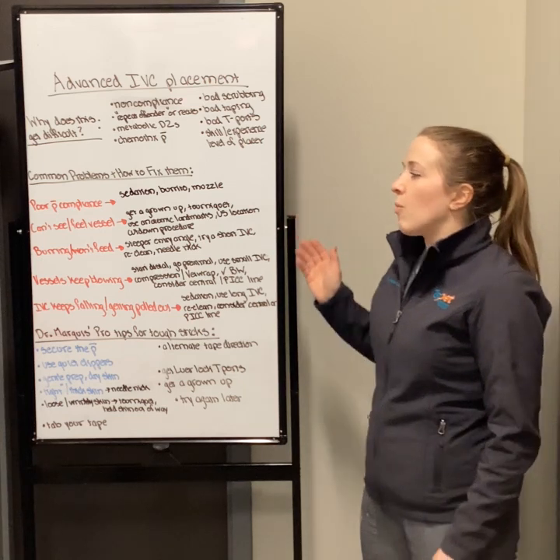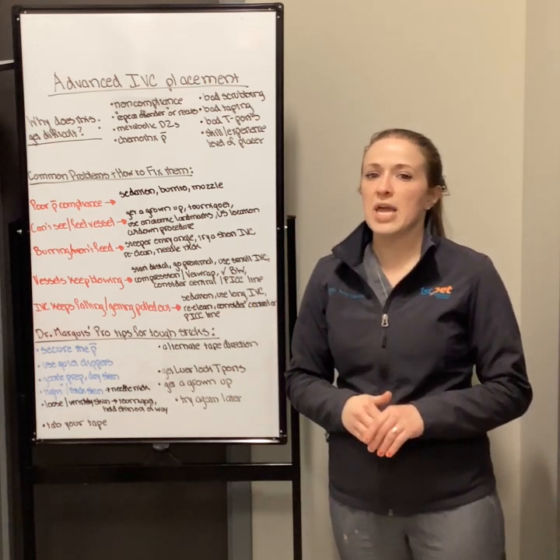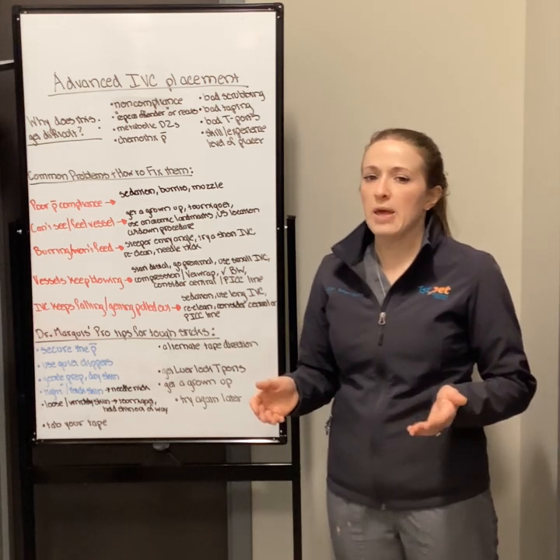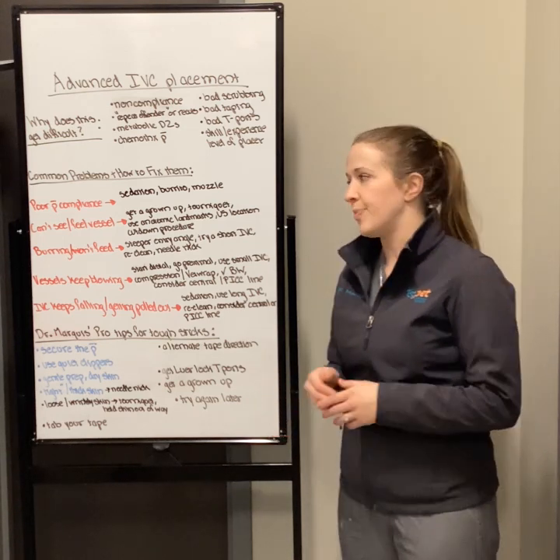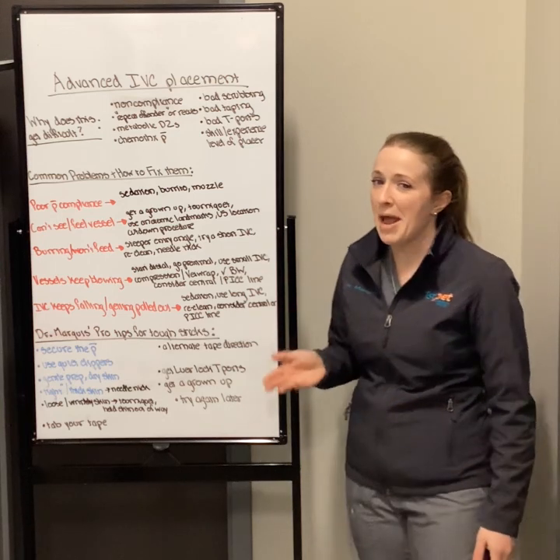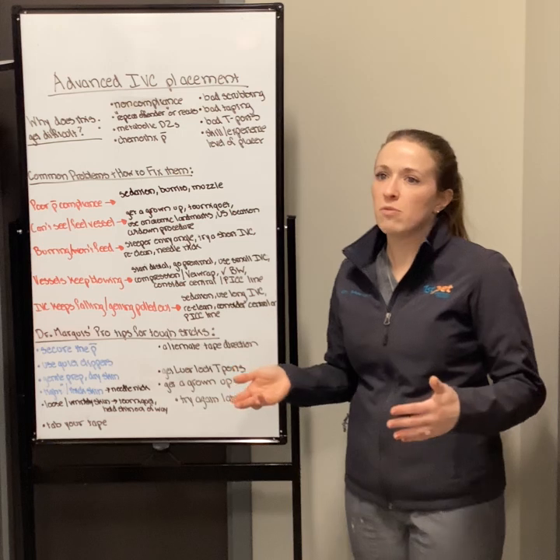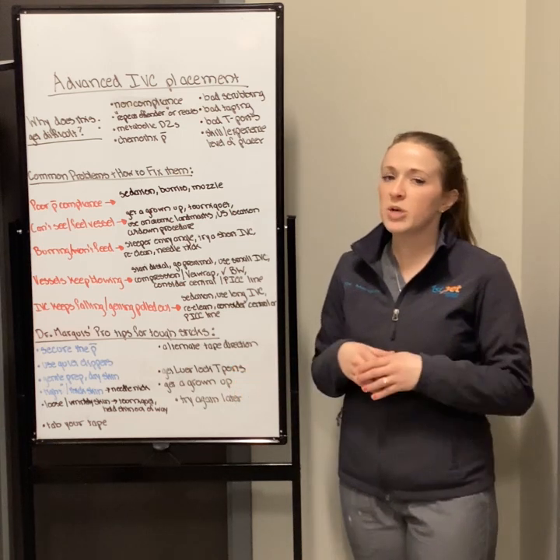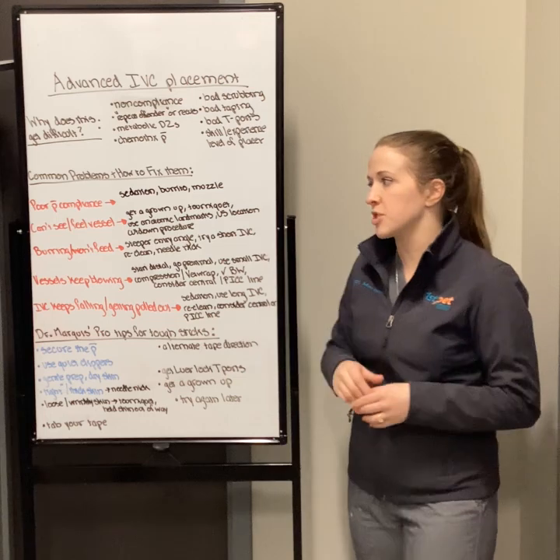So now I want to talk to you about a couple of specific problems that I see with catheters and what are the most common reasons that they happen and some things that you can do that are easy enough to fix them. Now, naturally, we can't prevent every bad thing from happening, but if you have an idea of how to mitigate risk, maybe the next time you have that situation, you at least have that information and can say, okay, got something in the toolbox for this.